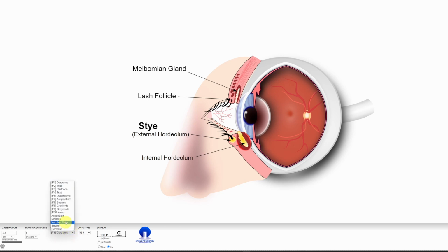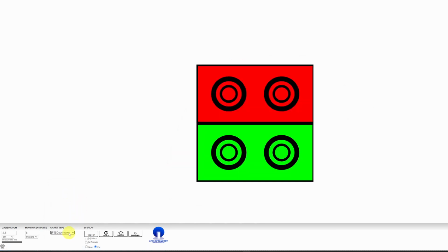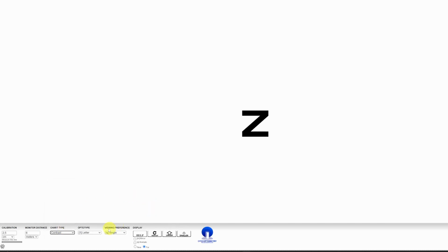It also has your duochrome test. Where is that hiding? Here we go, duochrome. And these are your buttons on your keyboard. So you've got diagrams, cartoons, text, duochrome, astigmatism tests. It also even has contrast. So you can have contrast.